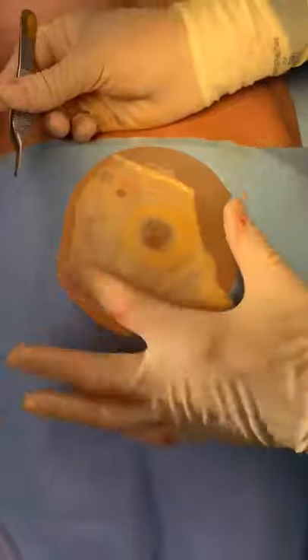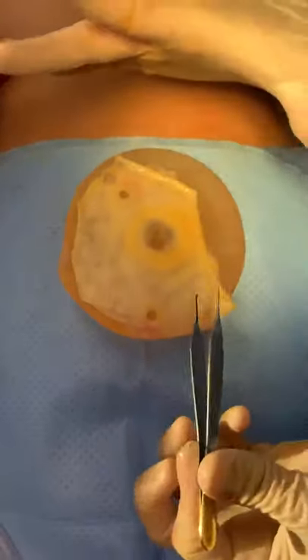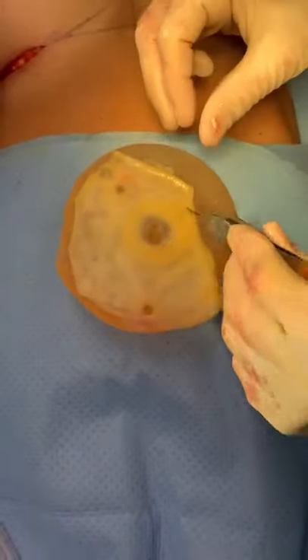We'll go ahead and get this old implant out and replace it with a nice smooth round gel implant that doesn't cause this issue.